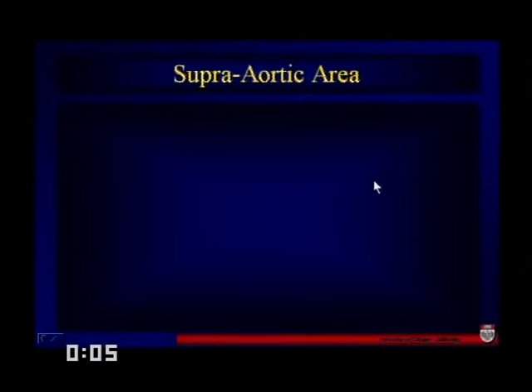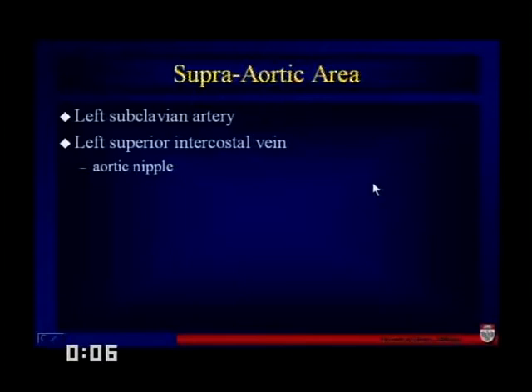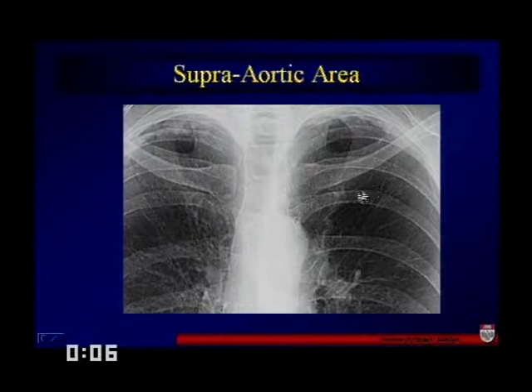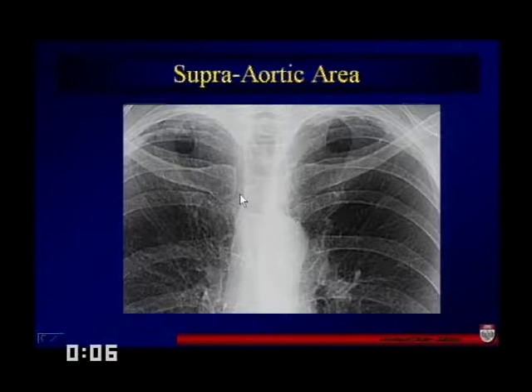The supra-aortic region and left paratracheal region should contain things like the left subclavian artery and the left superior intercostal vein — something that can sometimes show up as an aortic nipple. This is the supra-aortic area that includes the left paratracheal stripe. It's normally a little bit thicker and less defined than the right paratracheal region, fades off superiorly, with a well-defined aortic arch.